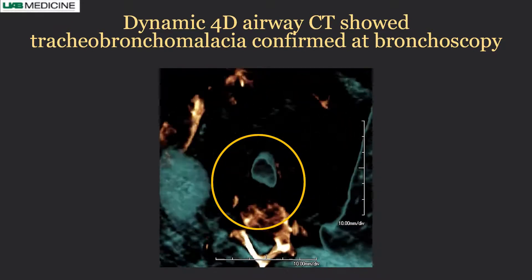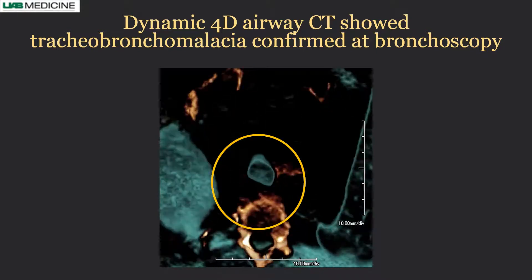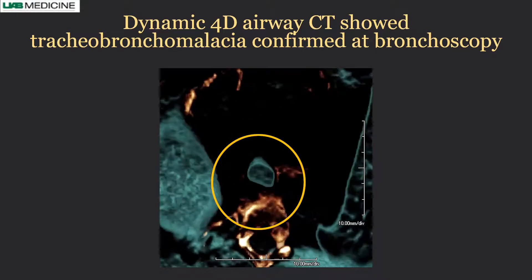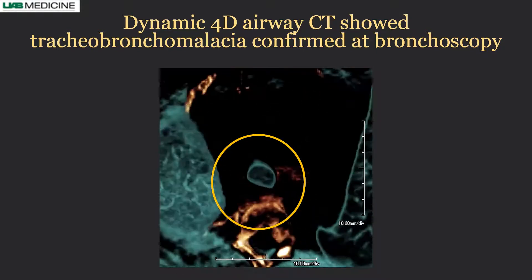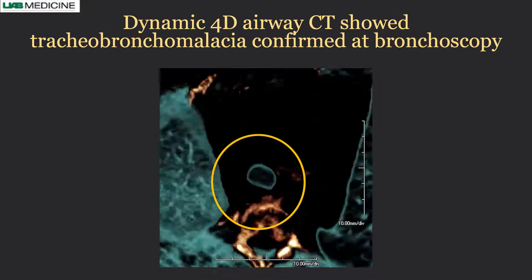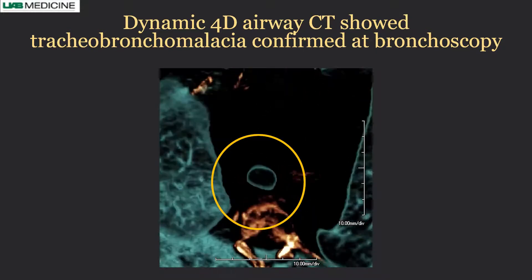This is a dynamic CT acquired with free breathing during scanning. During expiration, the entire trachea is collapsed — consistent with tracheobronchomalacia.